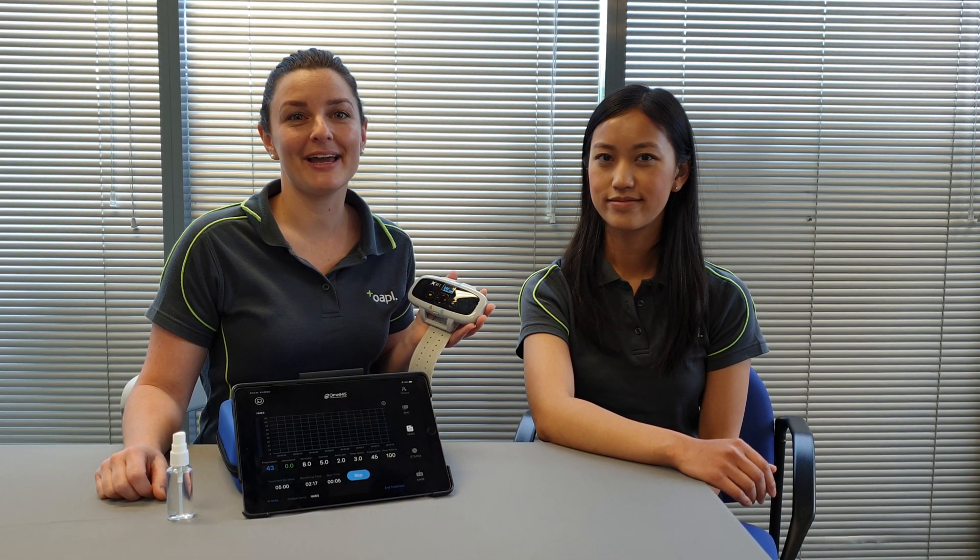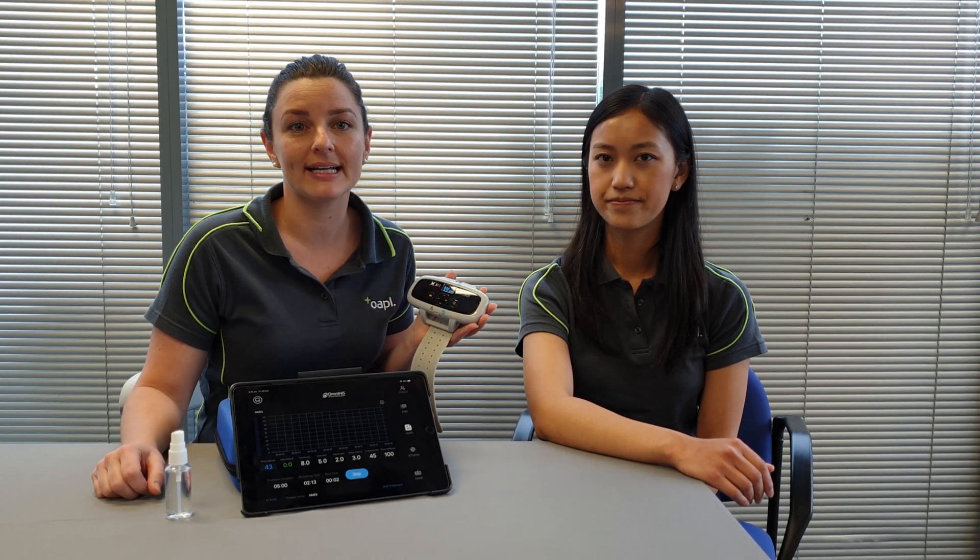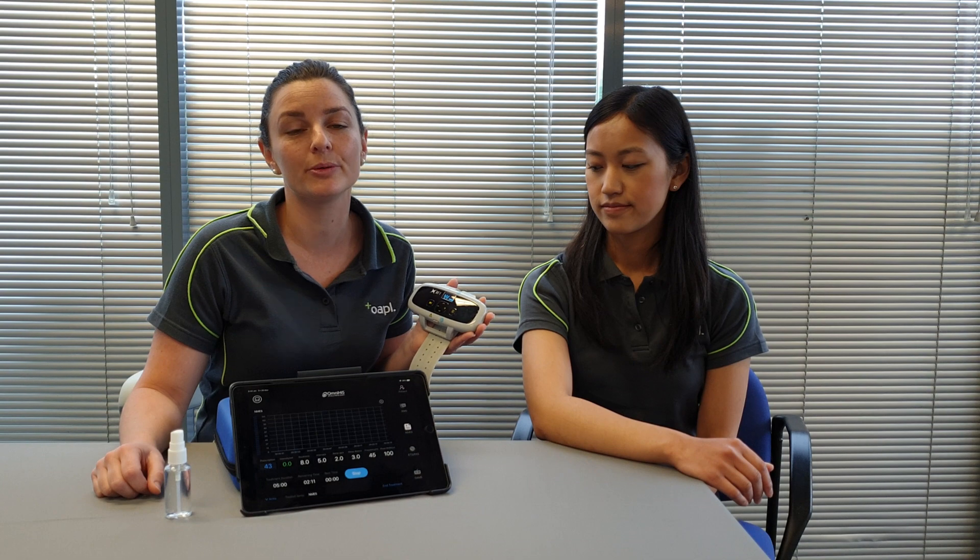Today we're introducing the OmniHi5 Upper Limb FES device. This device is designed to provide electrical stimulation to patients who are experiencing upper limb paralysis and paresis, potentially caused by stroke or MS.